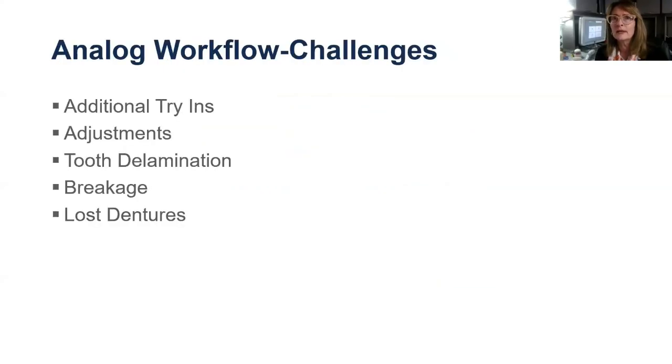So let's talk a little bit about challenges and successes as well. We're going to go back and forth a little bit between analog dentistry and digital dentistry, specific when it comes to dentures. And so what are some of the negatives or challenges about analog? Oftentimes there's multiple try-ins. Oftentimes there's multiple adjustments to the final denture once it's delivered.